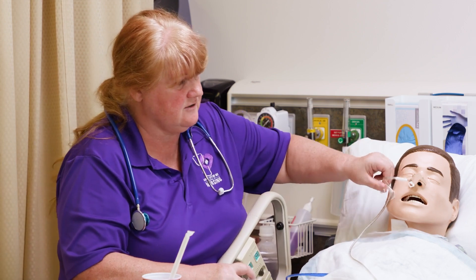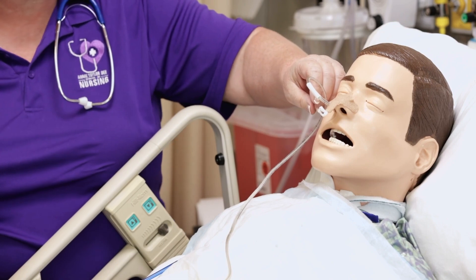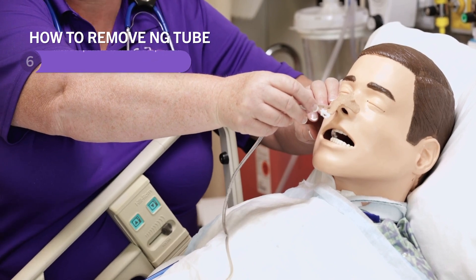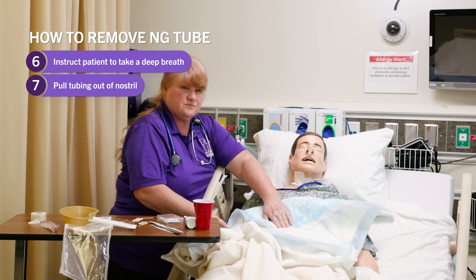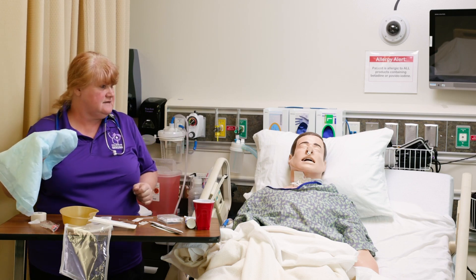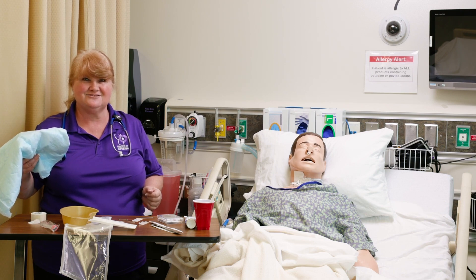Then we're going to undo the tube from the patient's nose and from their cheek. Tell them to take a big deep breath and hold it, and then pull it out. What's great about the blue chucks is you can just wrap all of this up in it and throw it out. And that's about it for nasogastric tubes.